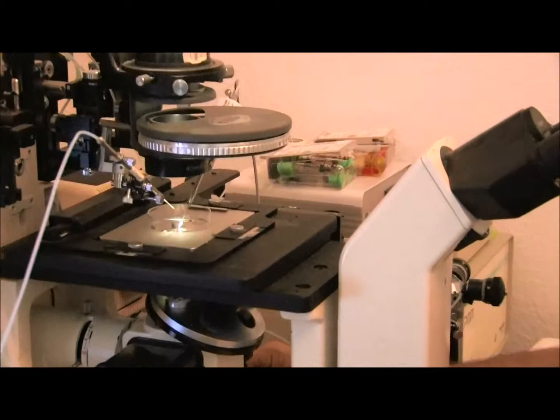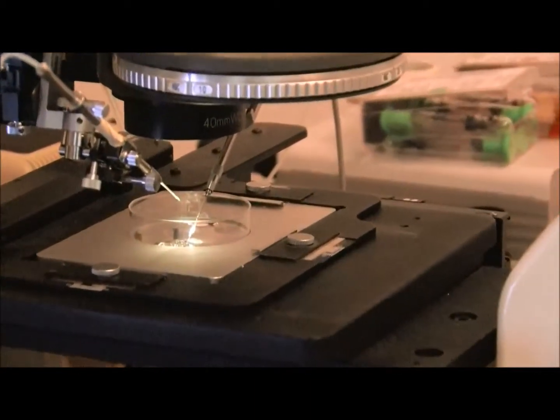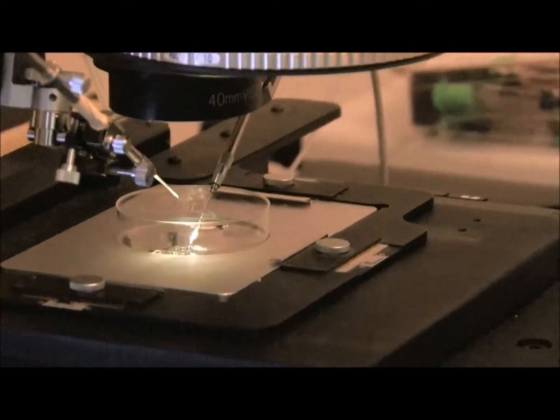This dish is placed under an inverted microscope that has micromanipulators which are controlled by joysticks to allow minute movement of the pipettes.